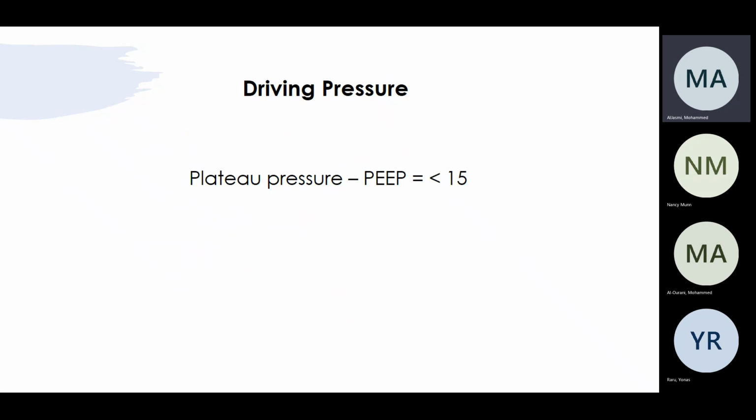If I go more in the PEEP, I went to 16 PEEP, 14 PEEP, which is only 2, and my plateau went to 35. That's obviously you're not recruiting. You're just increasing the pressure more. It's still less than 35, but you need to understand, no, I'm just stressing my lung more, and that increased the pressure. Let me go back down, give the lung some time, and come back again. Because if I go 2 and it goes 2, I go 2 and it goes 2.